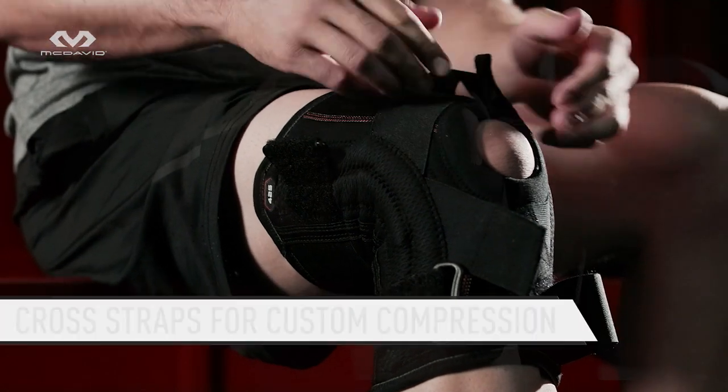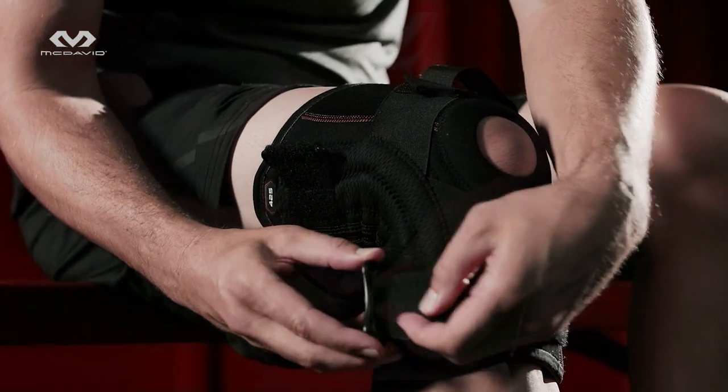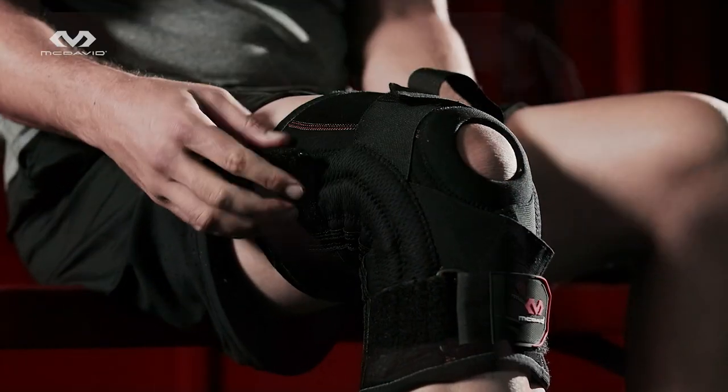The 425 is engineered to work on your right or left knee. Side stays add stability and cross straps allow custom fitting compression support adjustments.